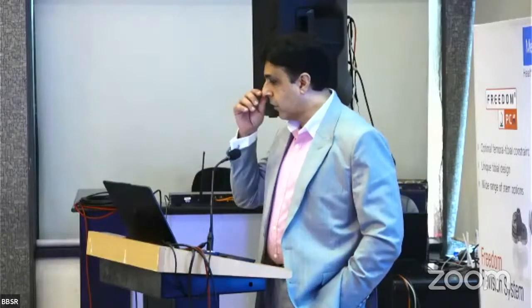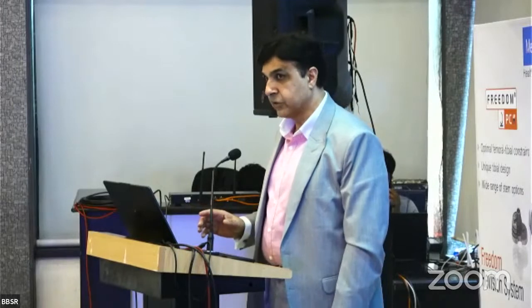She presented to us in 2013 with failed arthrodesis, moderate pain, and a demand for revision. Her infective markers were all normal. We tried an aspiration, ESR and CRP. This is what the picture was. Down there, you have the fasciotomy scar that she had. Up there, there was a Charnley compression device probably used for this patient for arthrodesis, which did not function. She was a stiff knee with hardly 10 degrees of range of motion. And this was the picture on the X-ray.